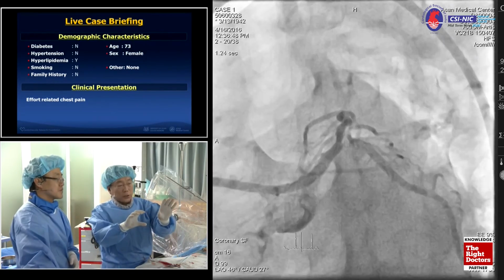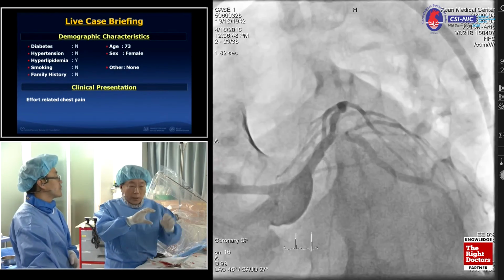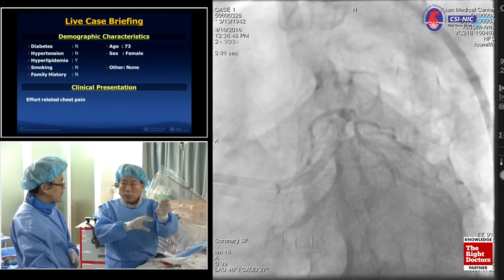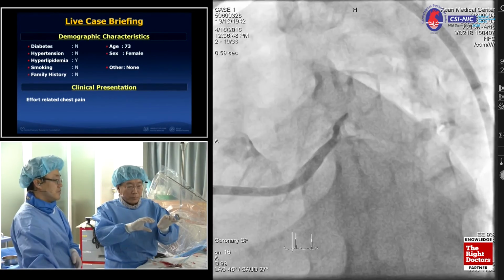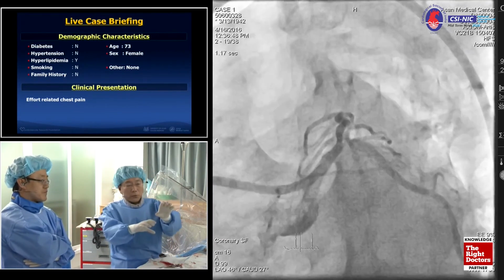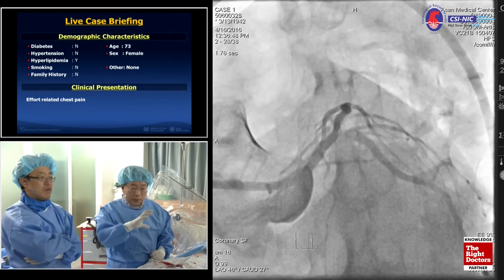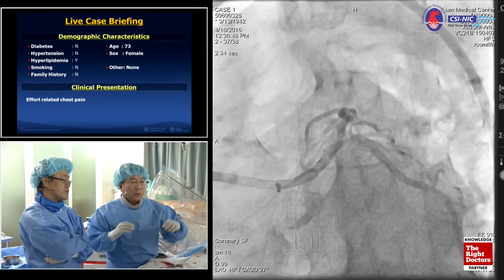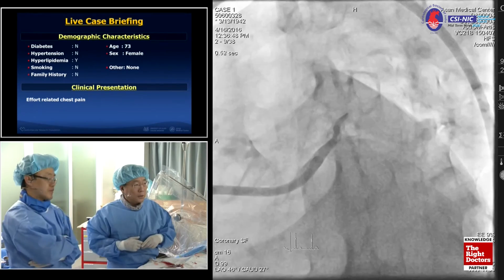from the beginning we discussed that. It's just the circumflex ostial part. We're going to choose another stent. And then the LAD side, depending on the morphology by IVUS, cutting balloon and drug-eluting balloon for the stented segment and a new stent. In terms of technical concern, particularly for these cases, I prefer the TAP technique, so minimal proximal stent protrusion in the main branch side. It is easier to do some procedures, even in complex left main disease. So that is our plan.